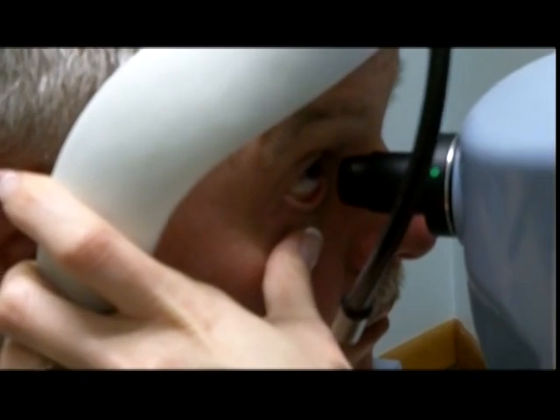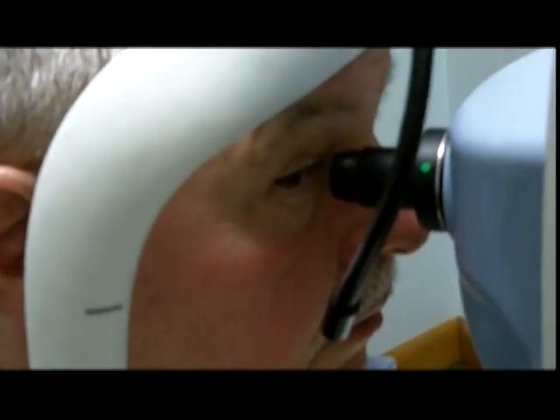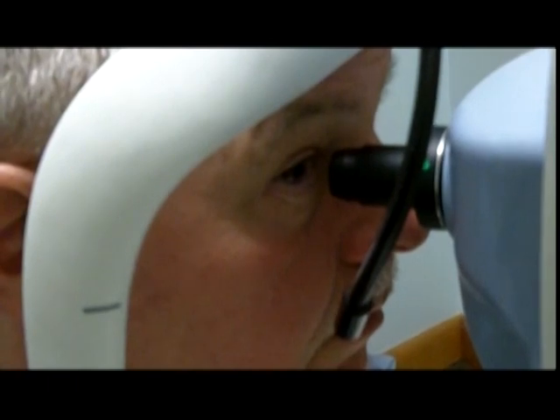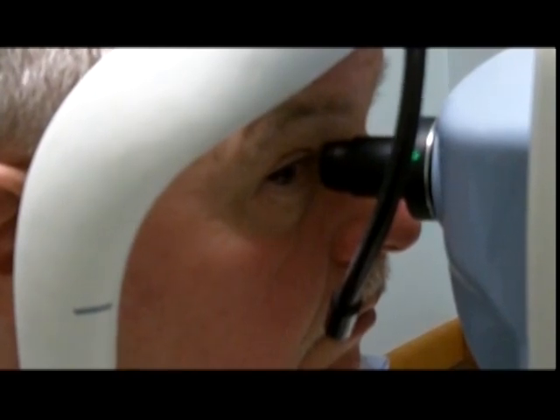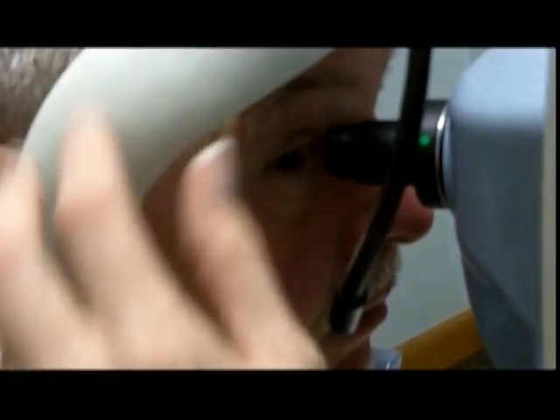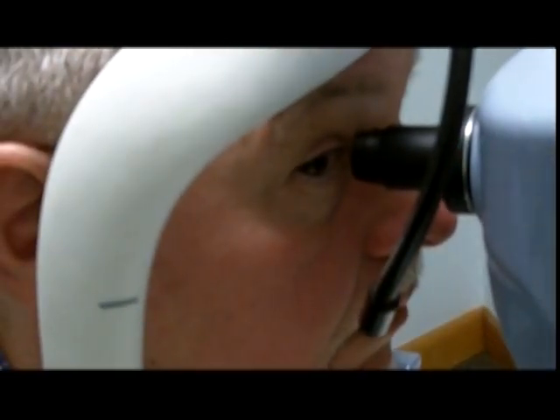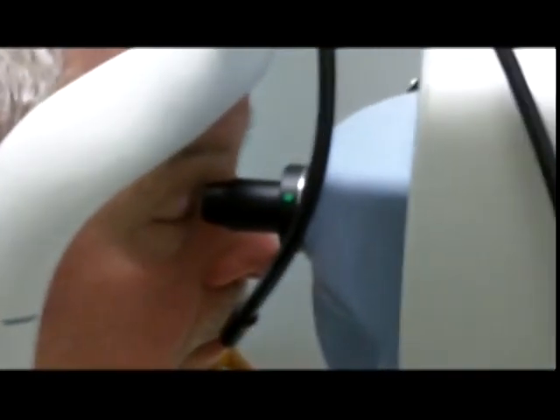When I have the patient looking to the right to evaluate the nasal part of the lens and how it's fitting, I get him in position. Depending on how wide the patient is keeping their eyes open — open real wide for me — he's doing a fine job. If the patient had tiny eyes, I would just grab the top lid. The same would apply when evaluating the lens temporally. An important part of doing the contact lens scans is for the patient's eyelids to be nice and open so we can get the full effect of the lens and the sclera and see how the lens is fitting.